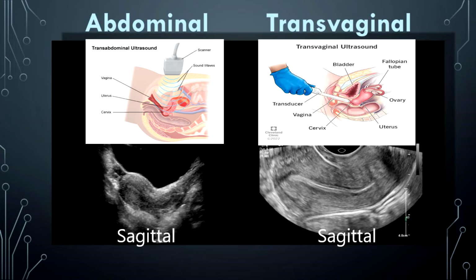No big deal. Typically, when we're going to use pelvic ultrasound, we're going to be using a transabdominal approach or a transvaginal. Transabdominal is right here. Transvaginal has the advantage that you're closer to the uterus. You can use a high megahertz endocavity transducer, up to 10 megahertz, even 12 megahertz, and you can get very detailed views of the uterus and ovaries. So this is a preferred method, but the transabdominal method is very good, especially in the pediatric population.